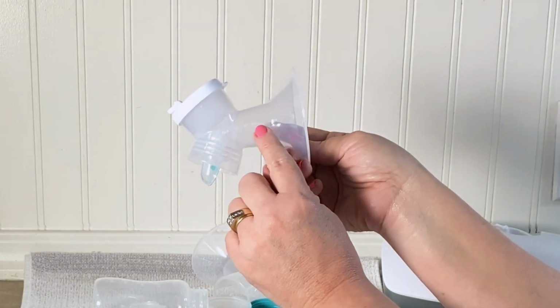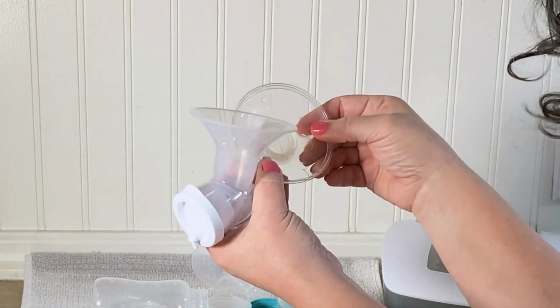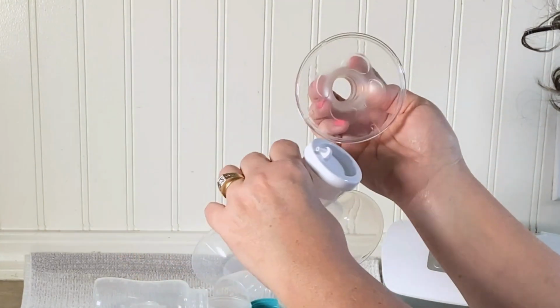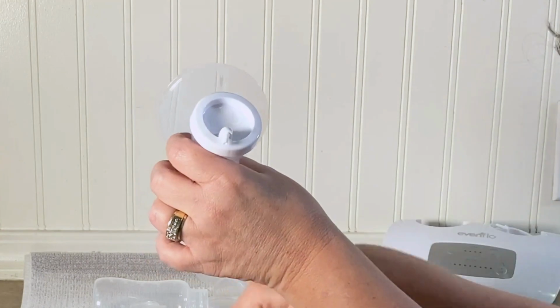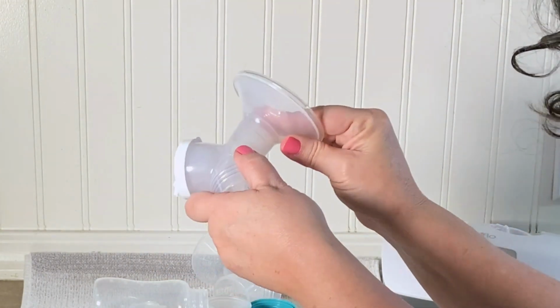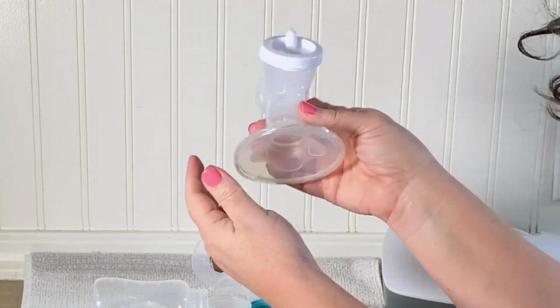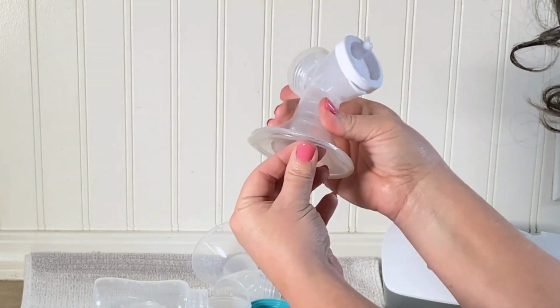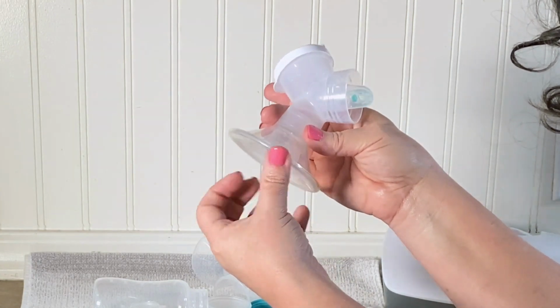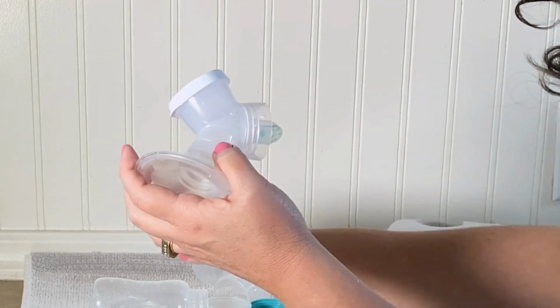All right, let's look at the flange part, the part that touches your breast. So on the side of the flange, it has the flange size written on it. And each of the inserts also has a size written on it. I'm going to put this pump together with 28mm flanges. So I'm going to find the insert that says 28, and then to put it in, you're going to push the tunnel into the hard flange tunnel. Just push it so it's all the way in, and then go completely around the edge of the insert. You'll find that the insert has a little lip on it that fits around the hard flange. You want to make sure that this is put together all the way around.